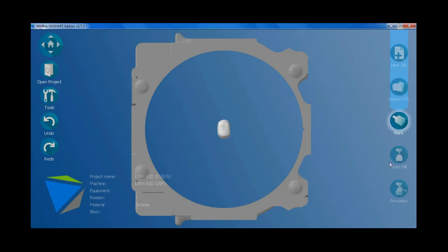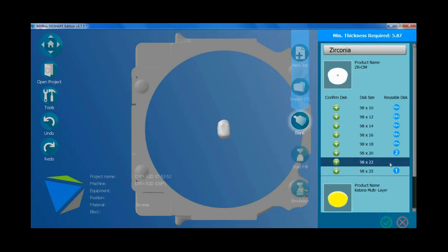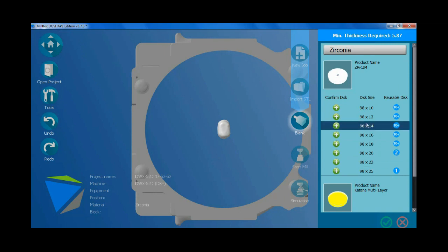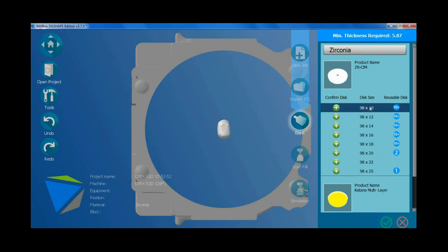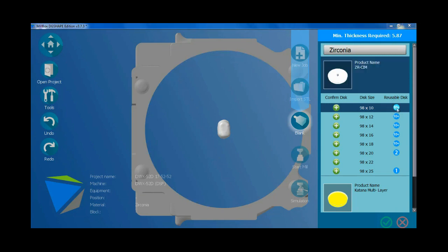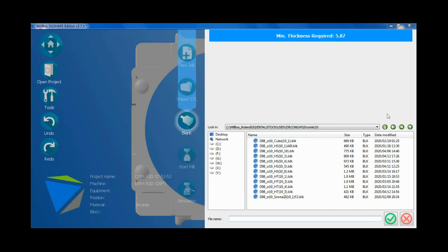Now I need to select the blank. Minimum thickness required shows that I need a blank with 10mm thickness. Blue option leads to window containing previous used blanks.